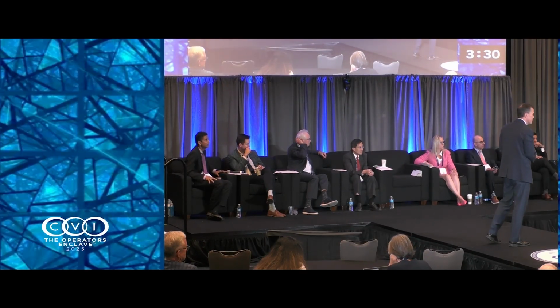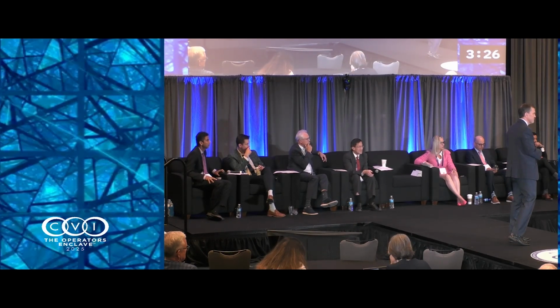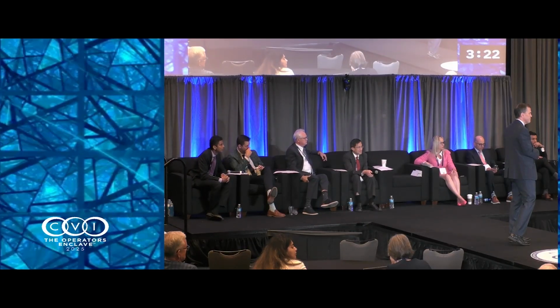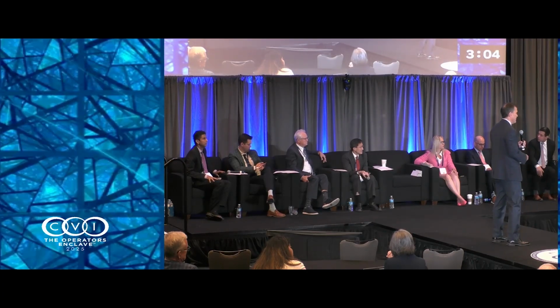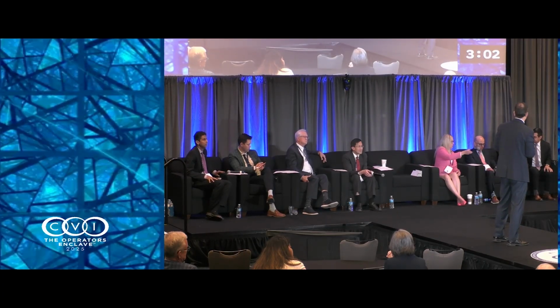PET scans which give us a non-invasive CFR. So in patients with an abnormal PET stress test with abnormal CFR, no epicardial obstruction or non-obstructive CAD on the cath, and if we don't have the Coroventis system, is that non-invasive CFR combined with evidence of ischemia on the stress test and abnormal CFR enough to make a diagnosis of coronary microvascular dysfunction, especially if you don't have access to Coroventis? So it's a great question.